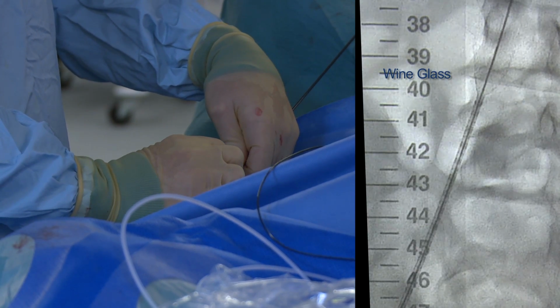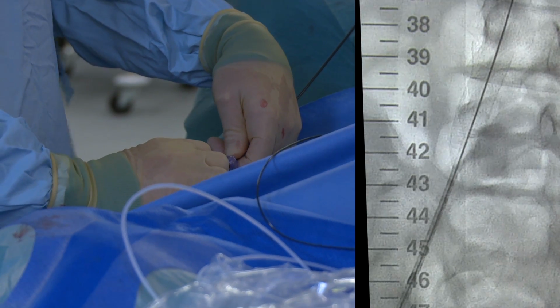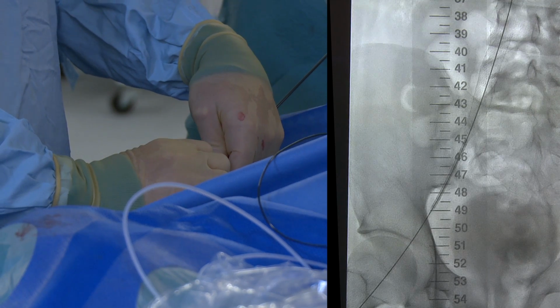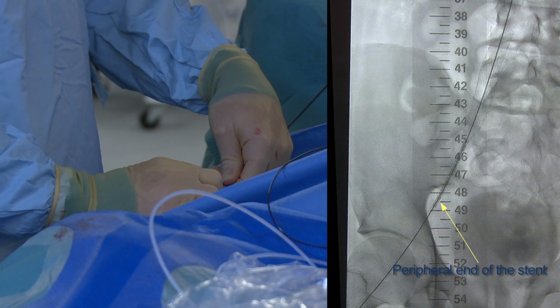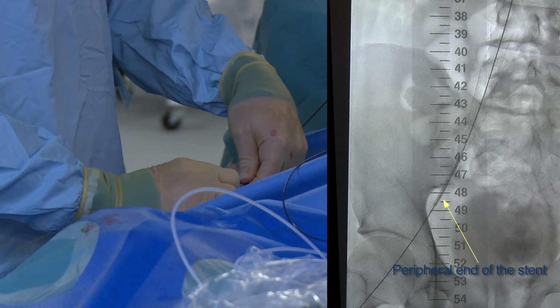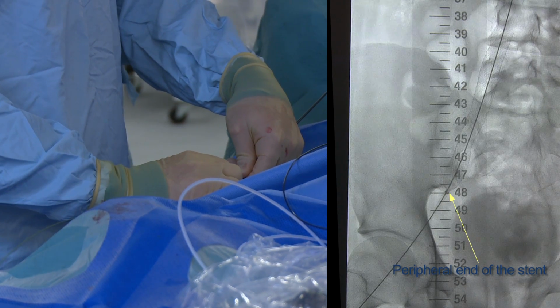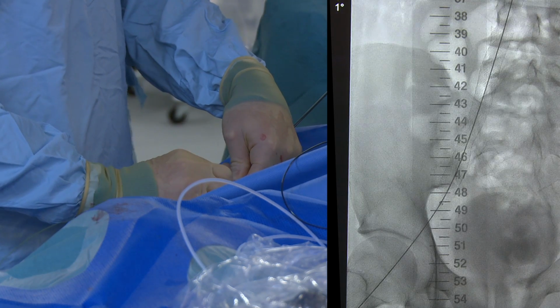It is important to note that the VICI venous stent cannot be recaptured at any point in the procedure, and do not push the inner shaft hub forward, as this could result in suboptimal location or failure to release the stent. The stent system foreshortens by approximately 10 to 20% during deployment as compared to the stent length when restrained in the delivery sheath.